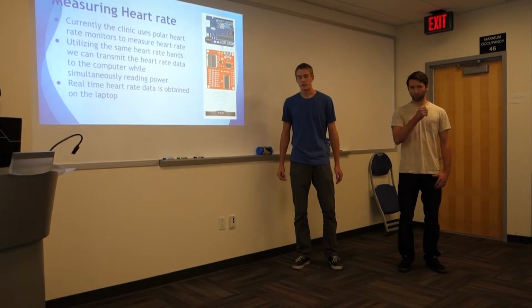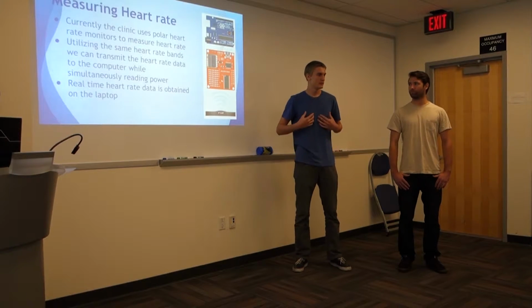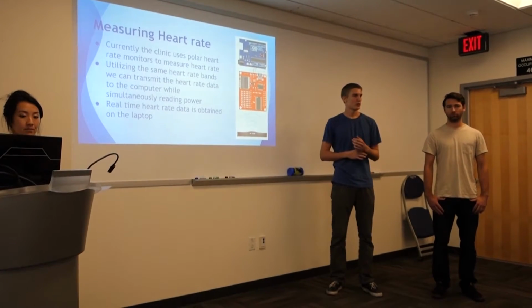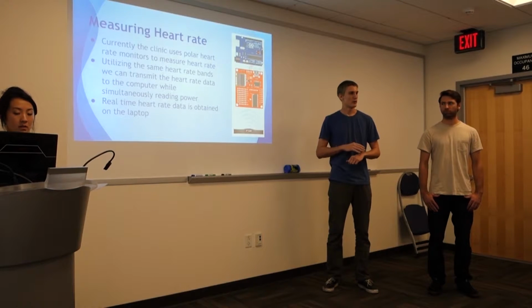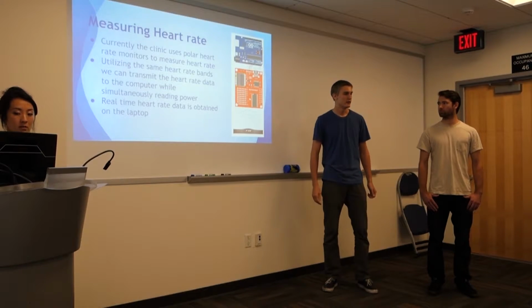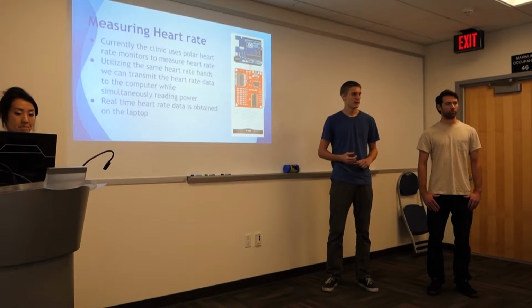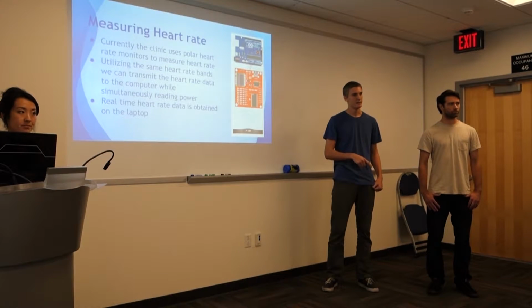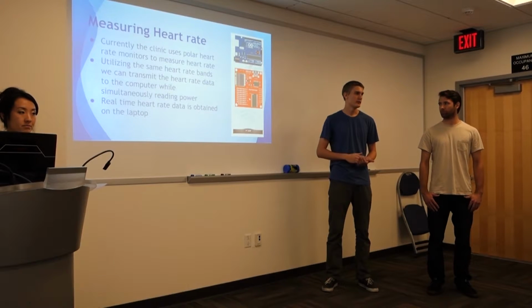So the way we're measuring heart rate in the clinic currently, they use this Polar heart rate band on the chest, but they also use the watch that goes with it. This works well and gives accurate readings, but the problem is it just flashes the heart rate at a certain rate. The physician can look at it and see what it is at a certain time, but it's not that useful in our sense because they can't graph it or have the data over a period of time while their work rate is changing. They can only know it at a certain moment.